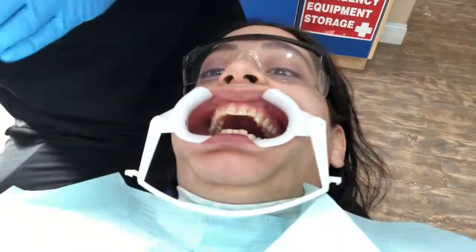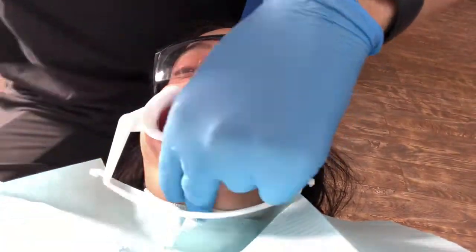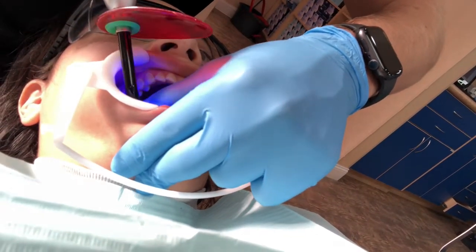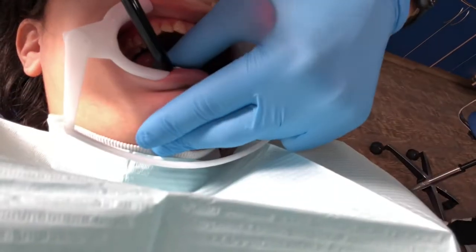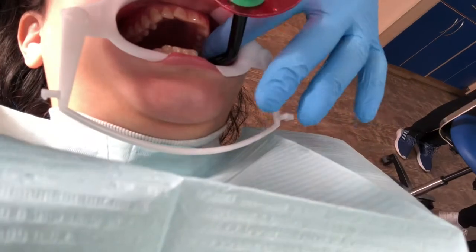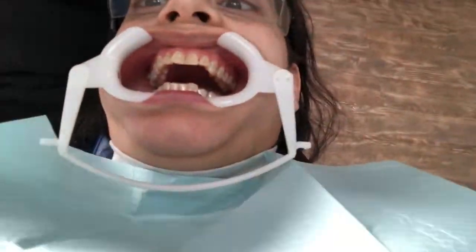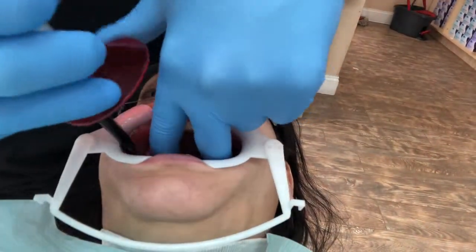He's added the brackets, everything is all in, and here are my lower trays. It does feel funny at first — feels like a bunch of plastic in your mouth. He's drying the brackets even more, not trying to stick them to the plastic of the trays, but just to ensure that they are there in their rightful spot so when I insert them they don't move. There goes the upper tray.